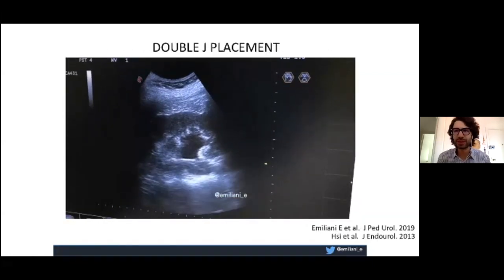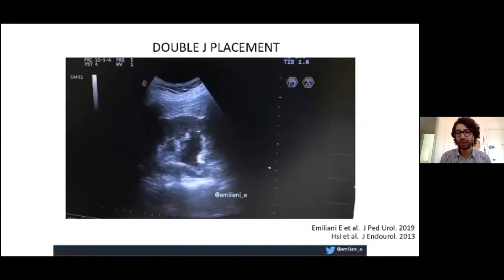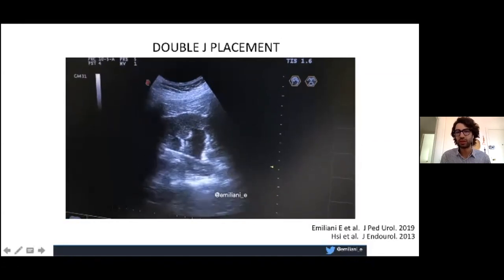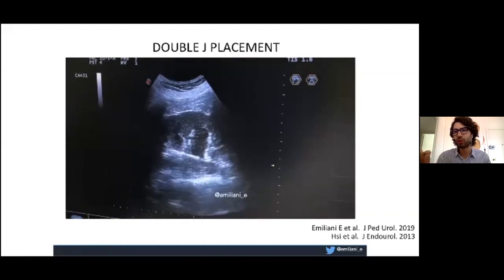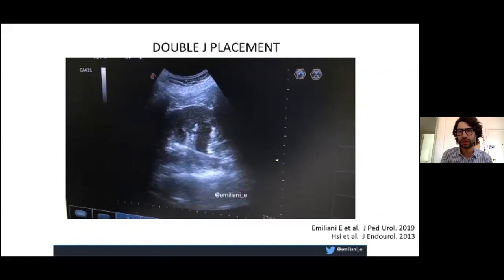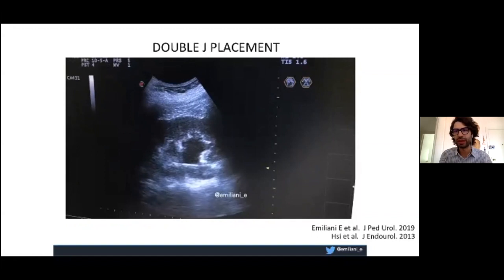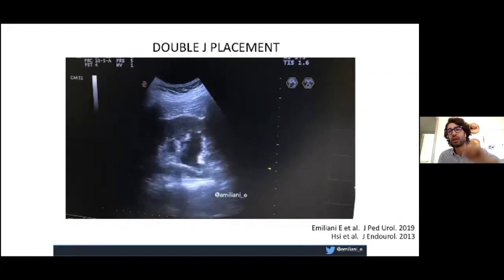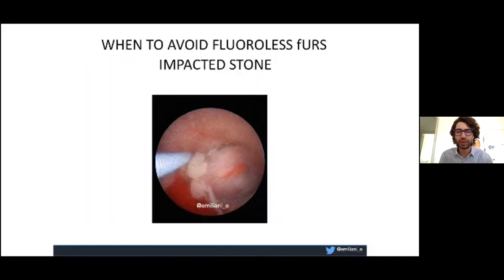For double J placement, I do two things. You can place it with ultrasound — you can see the guide wire and it will disappear as the double J advances up to the kidney. Or you can place it with endoscopy: when you leave the kidney, you know the guide wire is still in the kidney, so you can place the double J with endoscopy alone.